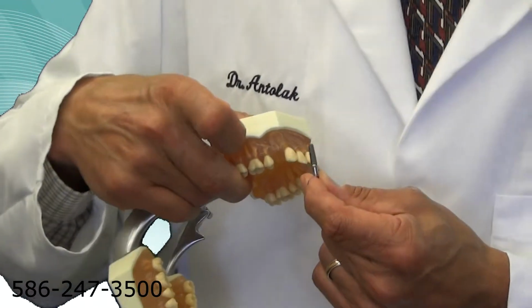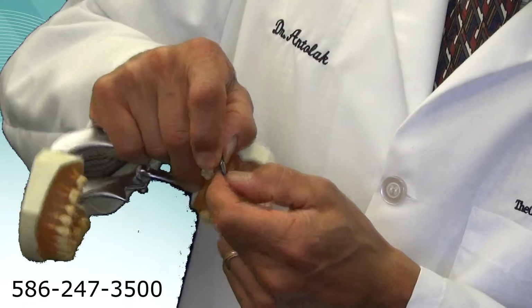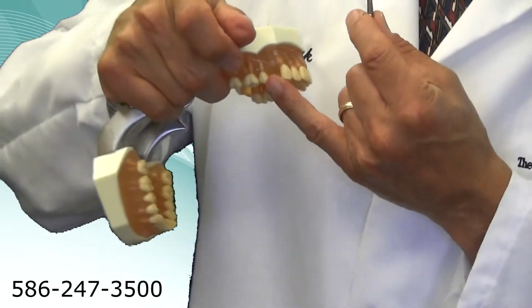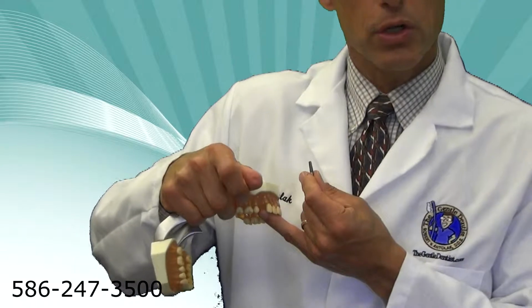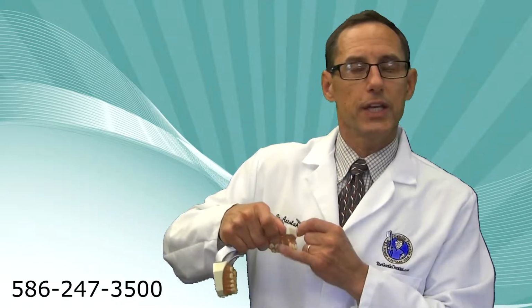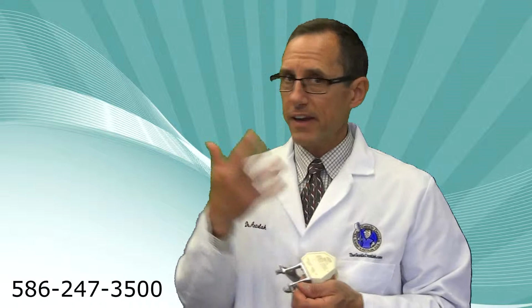So there's really 3 parts to a dental implant. There's the implant itself, there's the abutment, and there's a crown that goes over the top of that abutment that would then fill in this space where the natural tooth is. It's really critical to be able to floss your teeth. By doing that, you can floss between each tooth as if it were a natural tooth. It is a 1-to-1 replacement, so we're not affecting any other teeth when we do a dental implant.